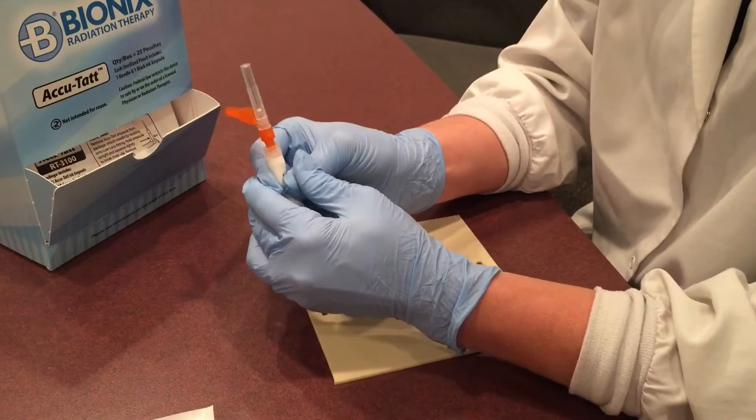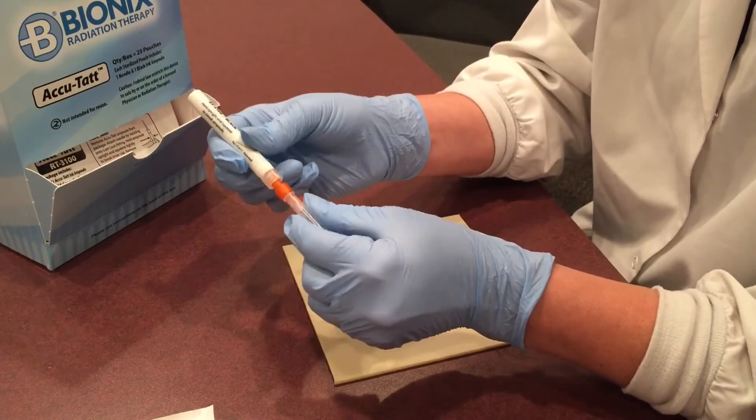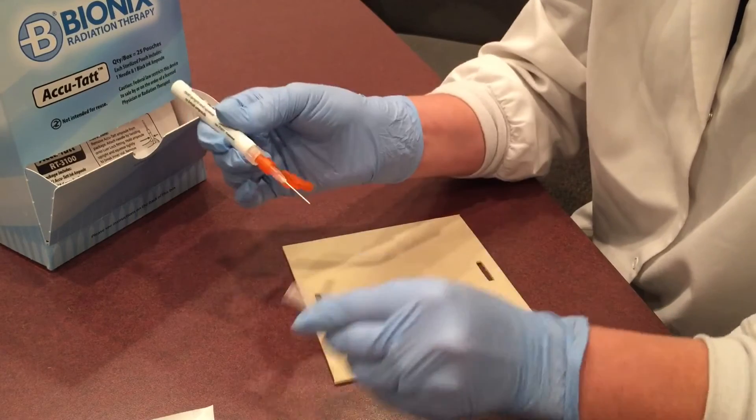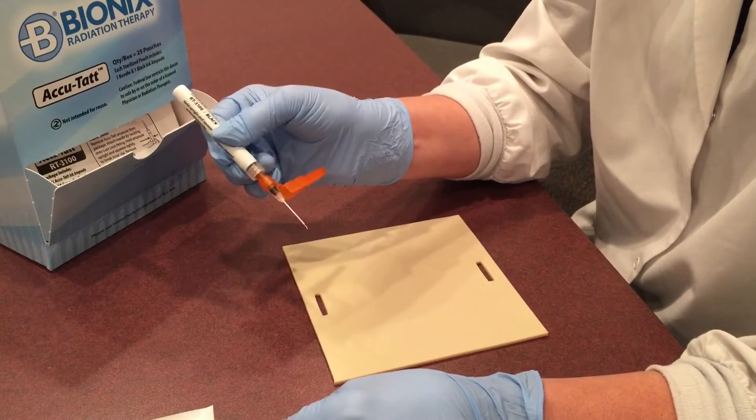It's important to break the inner vial completely so that the ink can flow freely into the head of the needle. Next, remove the cap and gently squeeze the product until you see the ink flow into the head of the needle.